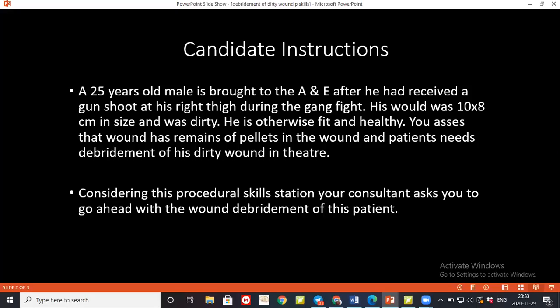After gathering all instruments, I'll assist to the procedure. First, I'll wash the surrounding area of this wound, then do proper sterile draping around it. According to the x-ray, I'll start wound cleaning. I'll take a swab and remove excess tissue debris. I will not put my hand in as there is a chance of injury from foreign bodies. I'll clean the wound in a clockwise or anti-clockwise manner, then flush it with normal saline using the syringe to identify any foreign bodies.